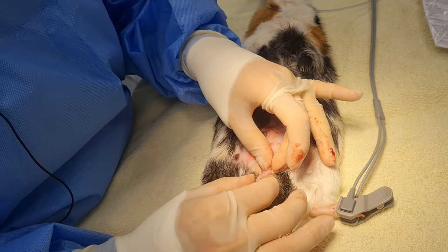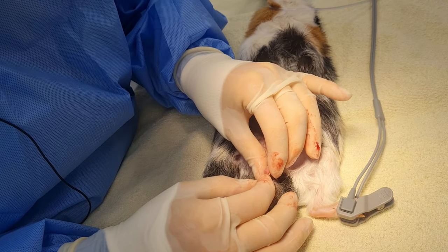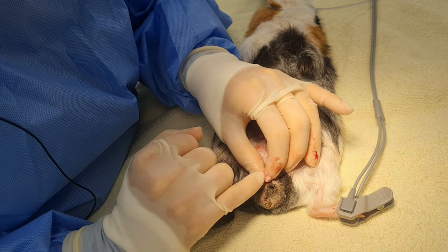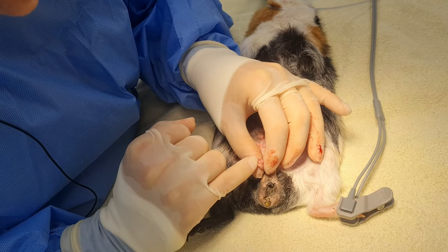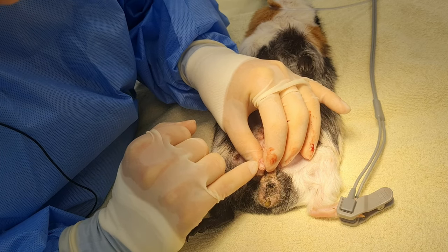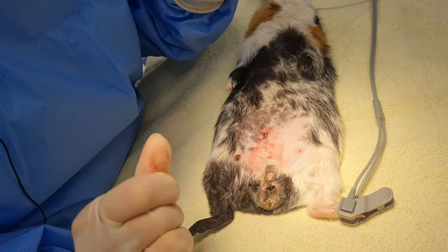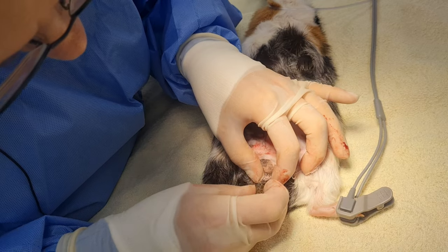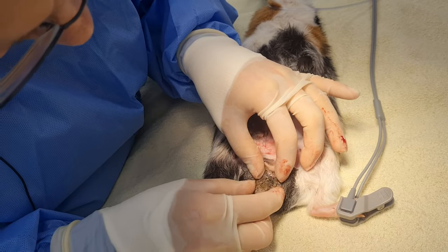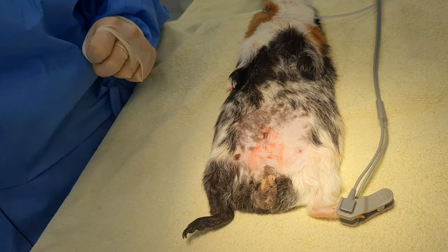A little bit of bonus anatomy that I never learnt when I was a student: if you exteriorise the penis of the guinea pig — and you do need to check it if you're investigating urinary problems — at the end there are two little spines, which are a bit weird. There is an os penis here, and the urethral orifice is actually further down. So if you ever need to catheterise one, it is not where the spikes are. Don't try doing that when you've got tissue glue on your hands. These guys quite often get a lot of debris in the perineal sac, and that usually improves significantly once they've been neutered.